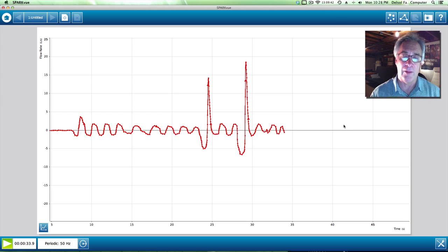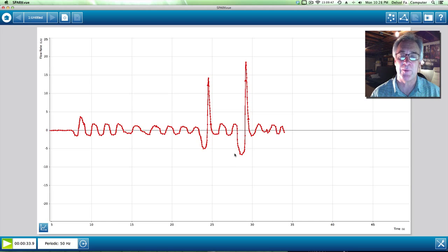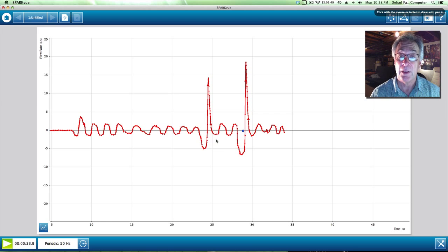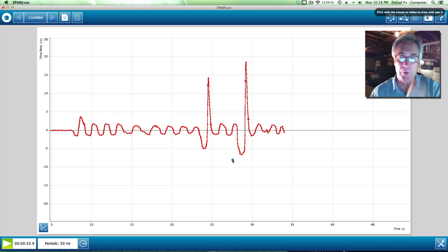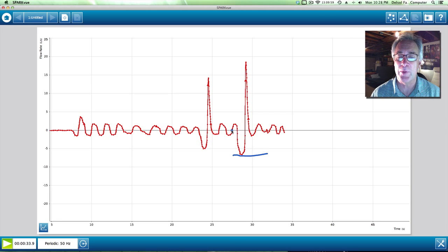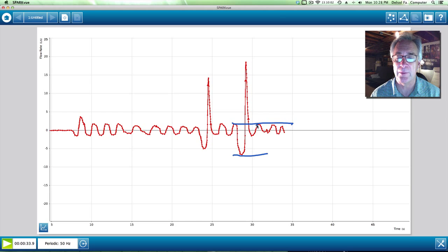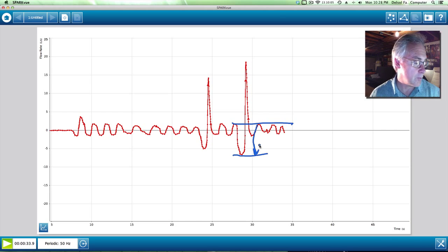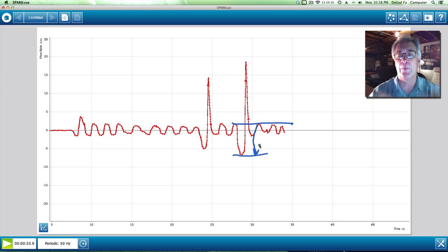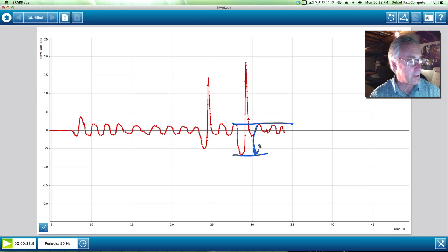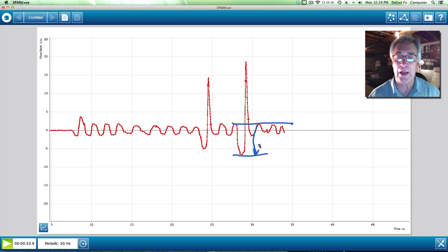Now, on the last one, I took a fairly, almost a maximum amount when I inhaled my inspiratory breath, I took a pretty big deep breath, almost maximum. And this would be, right here, my maximum or inspiratory reserve volume. That's how much my lung can actually hold. And then if we look at the whole thing altogether, that's called the vital capacity.